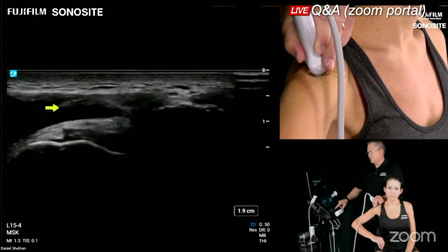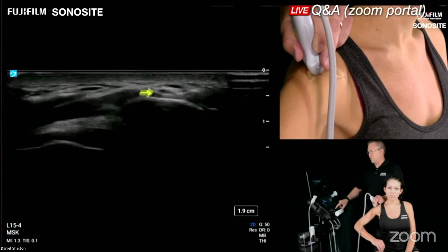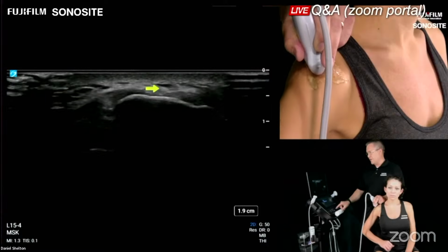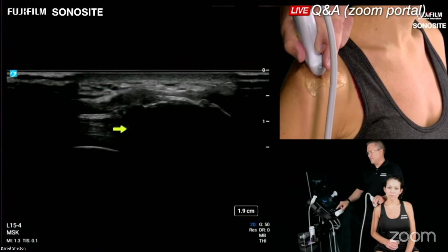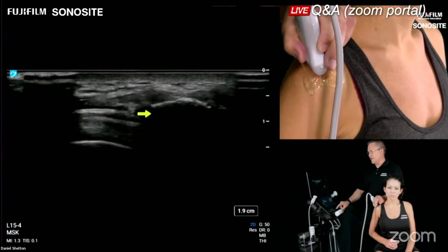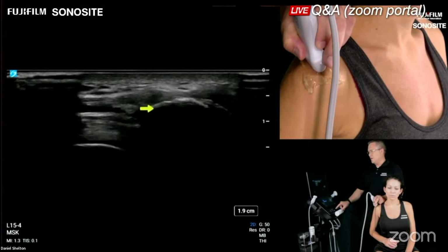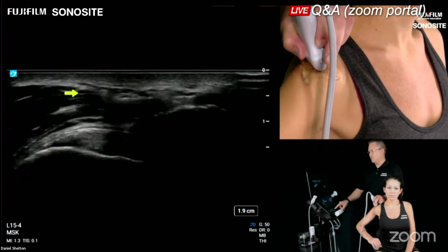And when the deltoid contracts, it can bump your transducer. So you'll notice all the weight of my probe is right here on the acromion, and I'm relatively floating the lateral side of the probe out here, letting the rest of the arm come up to the transducer. But I can see this interface nicely. While that provides a really nice consistent scanning surface, it also helps me know with confidence that I'm not collapsing the bursal interface with the weight of my transducer.